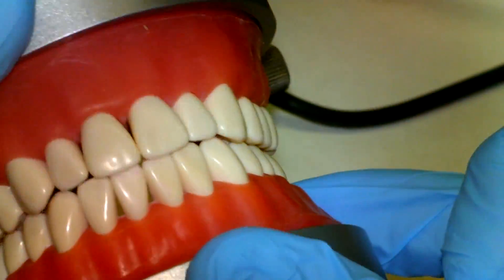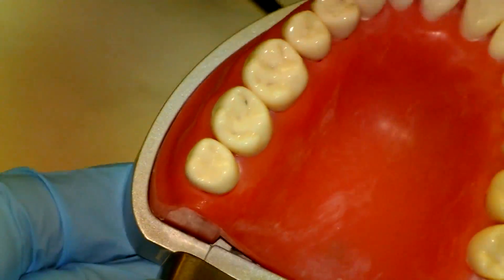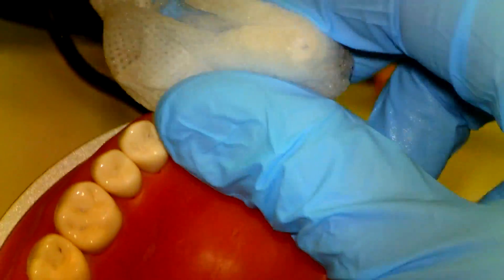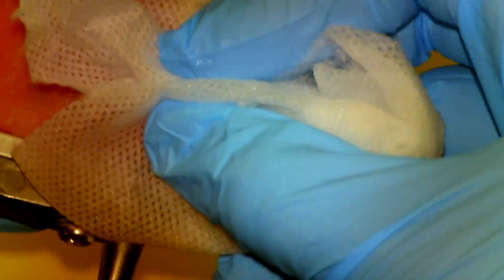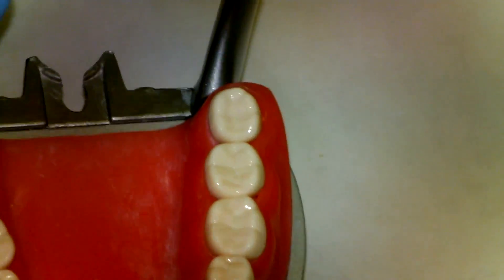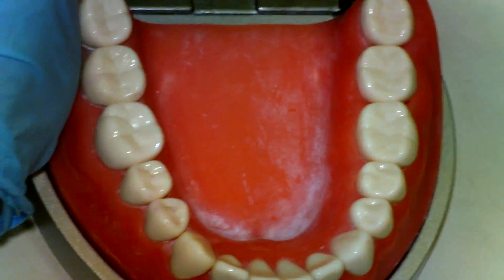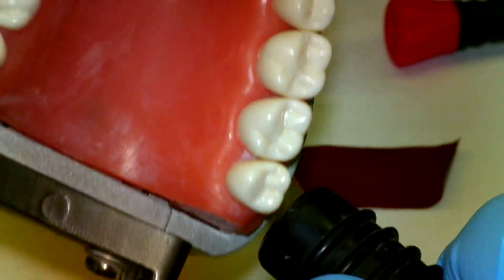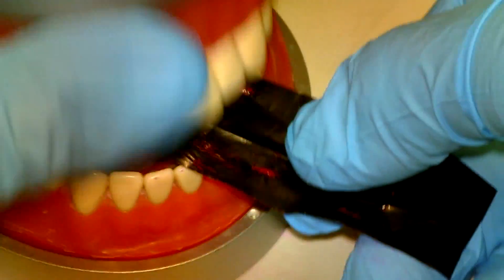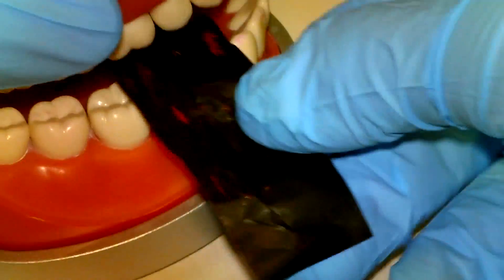What we should be left with are just marks on our functional cusp areas. When you're first starting out, it's a good idea to reset everything — take a two-by-two piece of gauze soaked in alcohol and wipe it down, or use the cavi wipes we have for you. Continue wiping to get a fresh start. Make sure the teeth are dry before you re-mark, using gauze or your air syringe to dry things off.